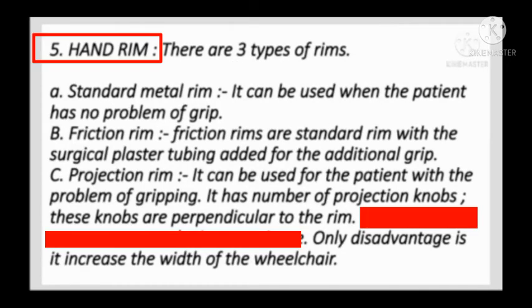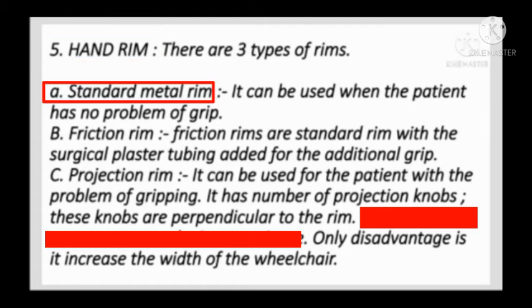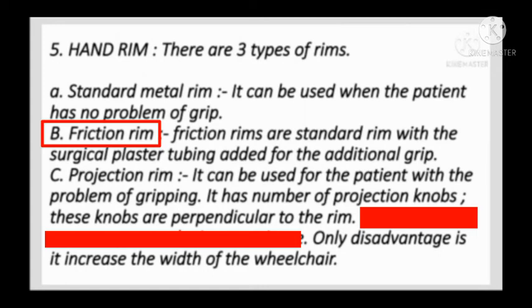Hand rim. There are three types of rims. Standard metal rim: it can be used when the patient has no problem of grip. Frictional rim: frictional rims are the standard rim with surgical plaster tubing added for additional grip. Projection rim: it can be used for a patient with a problem of gripping. It has a number of projection knobs. These knobs are perpendicular to the rim. The only disadvantage is that it increases the width of the wheelchair.